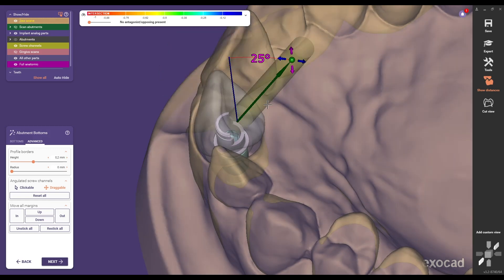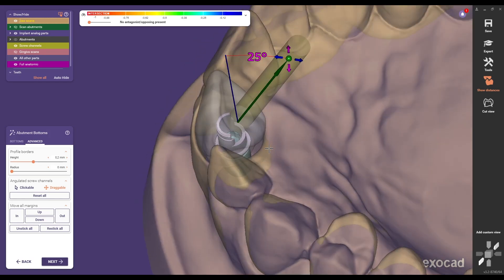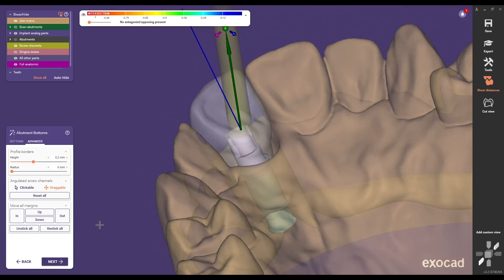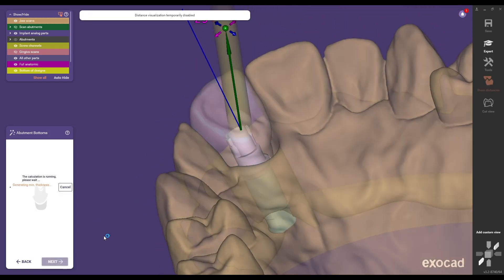For screw retained bridge and bar applications Medentica's titanium bases can rotate steplessly 360 degrees around the implant axis.